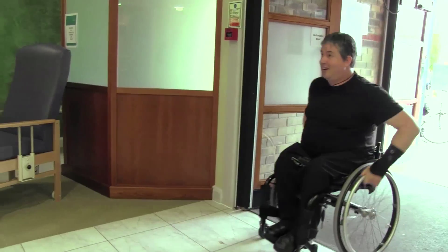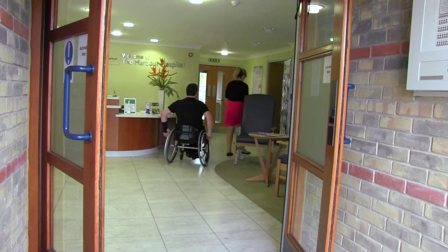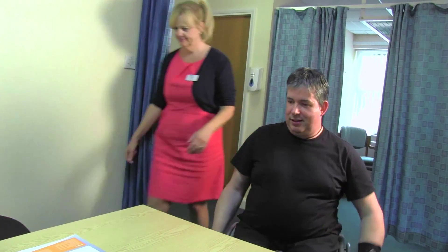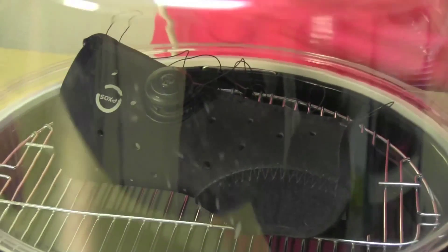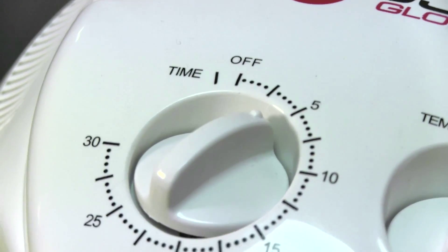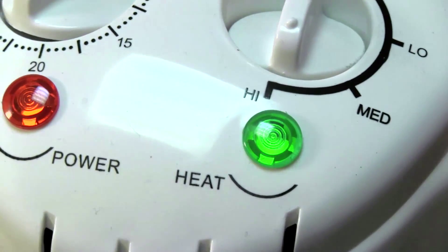The Exos Wrist Brace is a thermoplastically based splint, so it has a plastic inner lining that is externally and internally lined with a really nice soft fabric. It's unique in the way it's formed and how you make it fit to your patients. All we have to do is put the brace into a warm air heater. It takes a few minutes and the thermoplastic component inside the splint becomes soft, then the brace is applied to the patient and as it cools it sets to the position that you want.